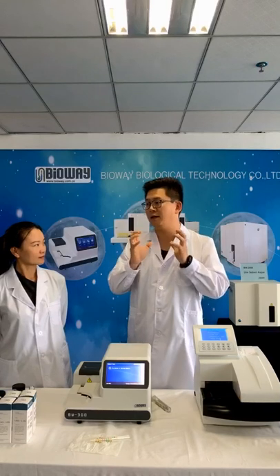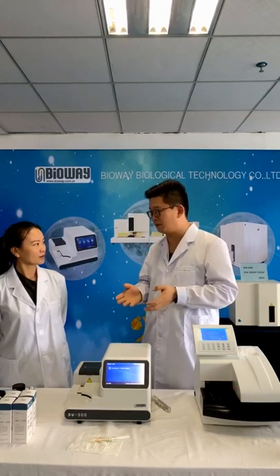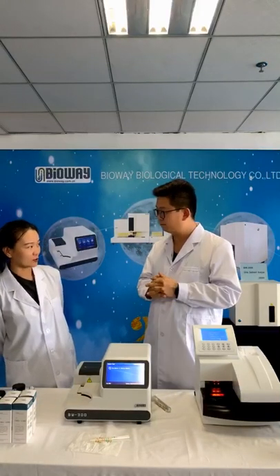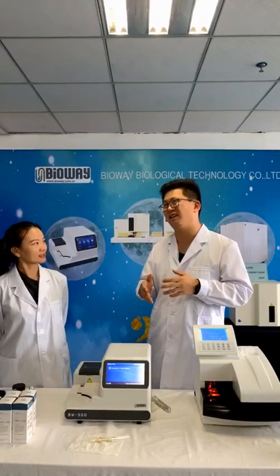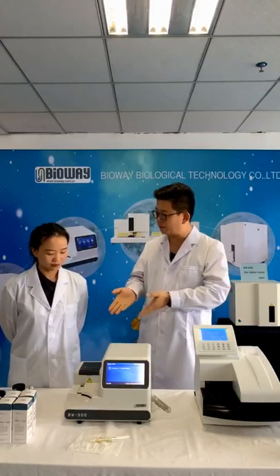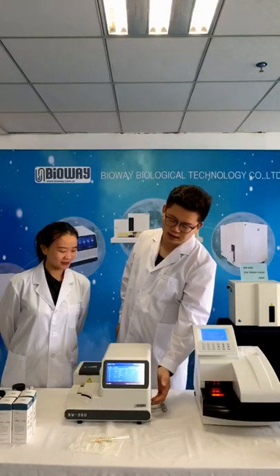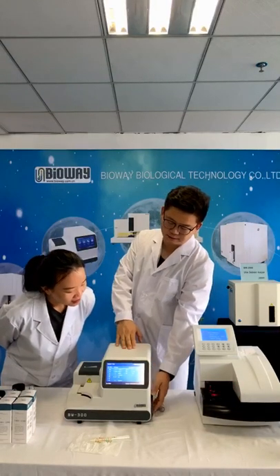This time is for the urine strips and the urine sample combined, as they might have some chemical reaction, so this time is just for the reaction to happen. About 20 seconds? It's more than 20 seconds, approximately 25 or 27 seconds. No, less than 30 seconds. Yes, less than 30 seconds. And the results will immediately come out. Let's wait for that. Okay. There's no image space. We also have a box to collect the waste strips, in this flank on the left side.